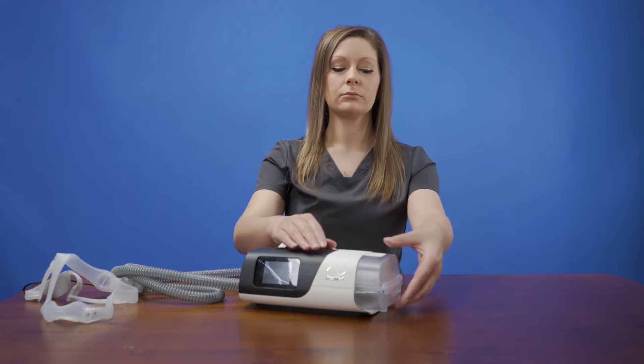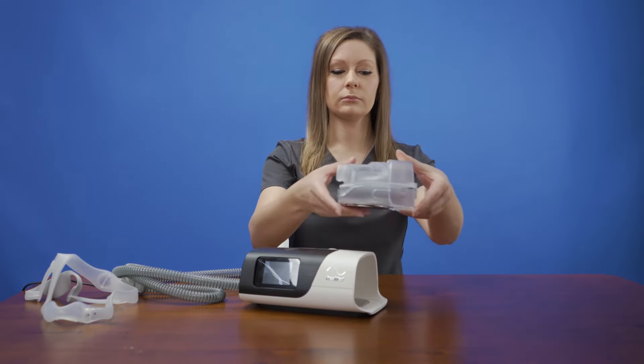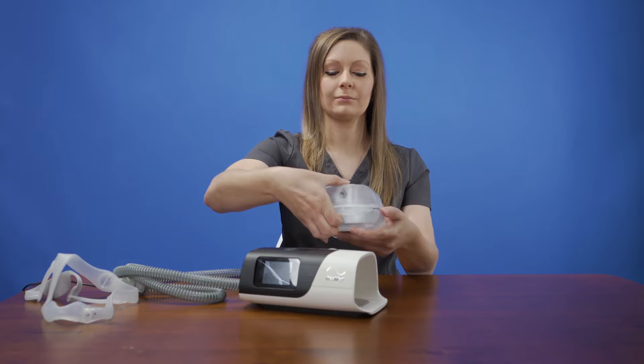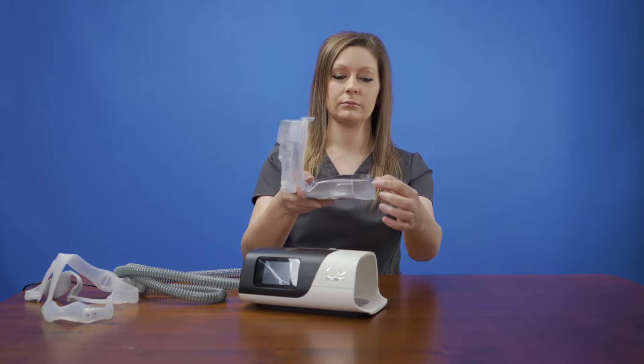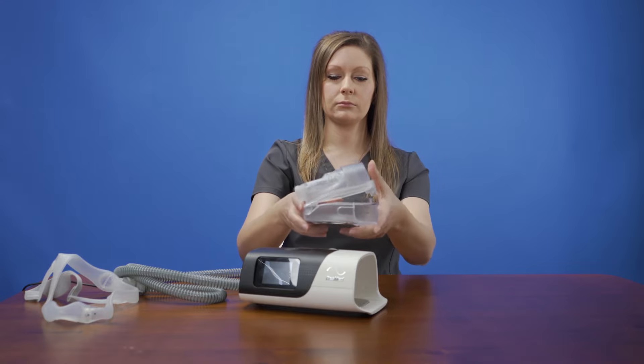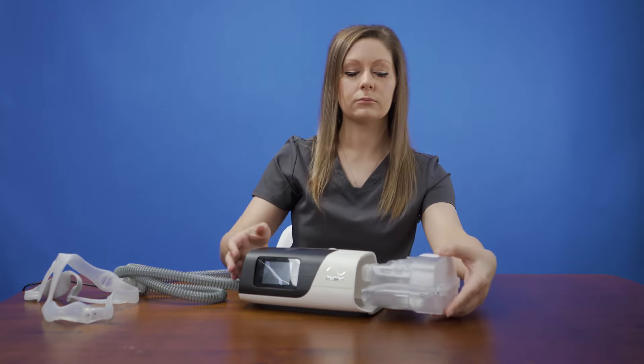On the right side of the front of the machine is the humidifier. To remove the humidifier chamber, place your thumb on top and fingers on the bottom of this part of the unit. Squeeze down and slide out. Once the chamber is out, you will see a tab on the top right of the chamber.